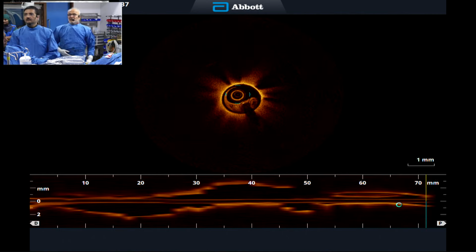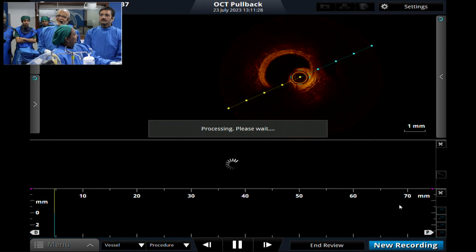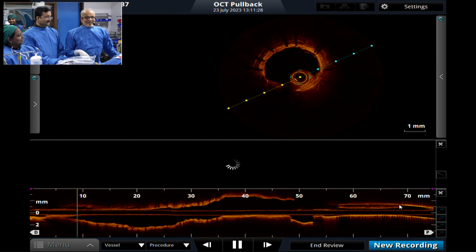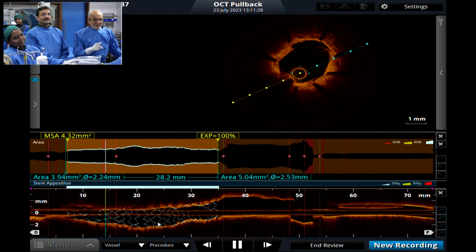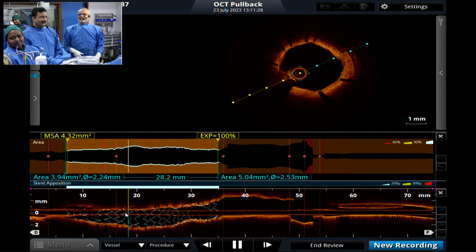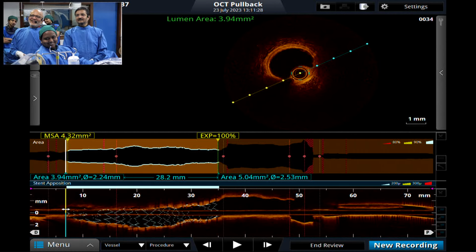Again, very good looking image, like a clean image. I think Sanjay Bhai's injection is something we need to see. You know what he does, Samir? He is not worried about the timing of injection by that blue scale. He sees the movement of the catheter and then he injects. The percentage of good images that we get in Apex is well in excess of anywhere else.